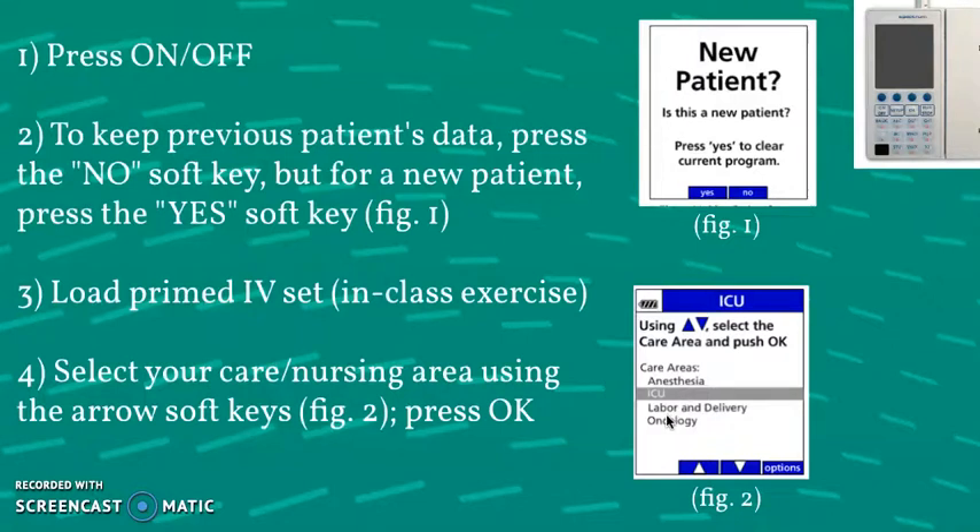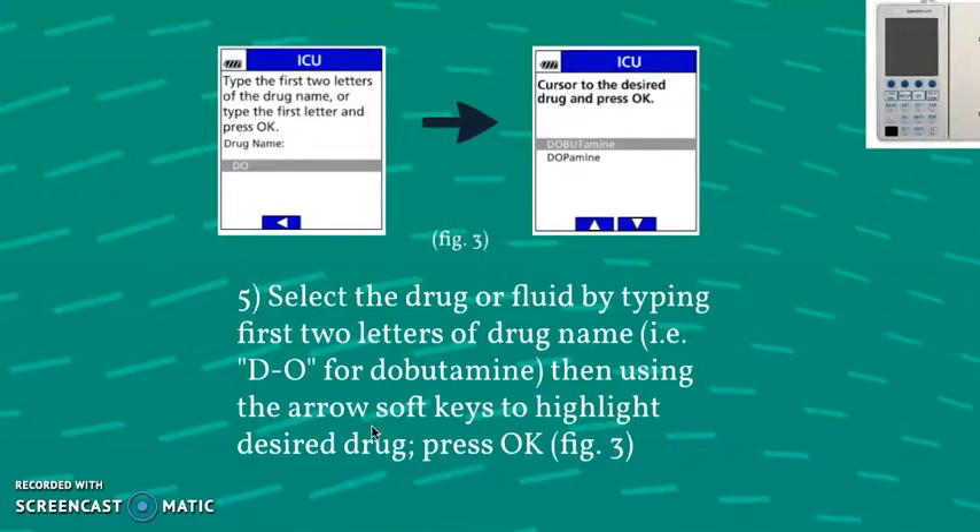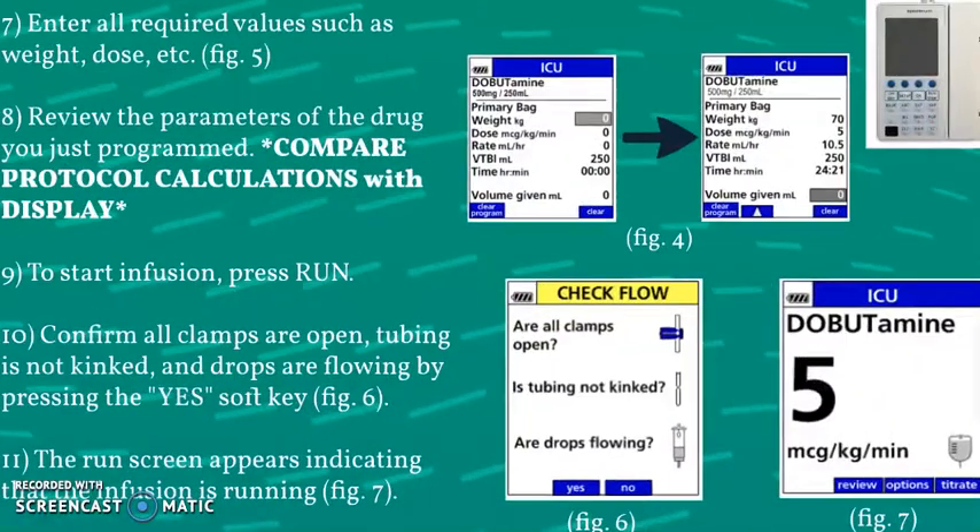Selecting your care area helps you find the built-in library with the intended medication for administration. The next step is to select the drug or fluid you will be running by typing in the first two letters of the drug name — for example, DO for dobutamine — then use the arrow soft keys to highlight the desired drug and press OK to pick it. The screen will then prompt you to enter all required values such as the patient's weight, the drug dose, the rate, and all of that will calculate the time needed to run that medication.